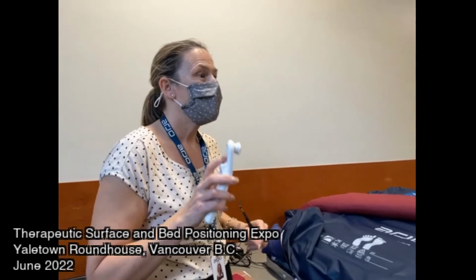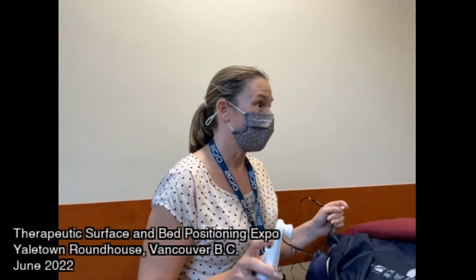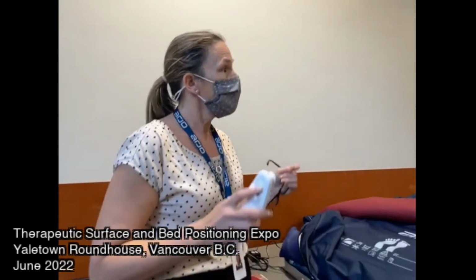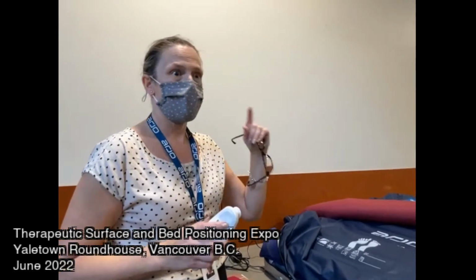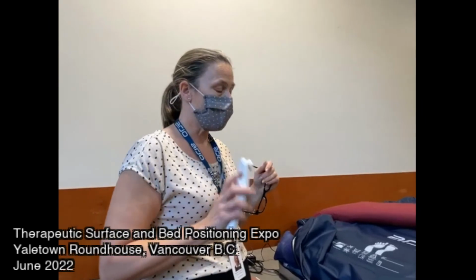Oh, interesting. So you could prevent pressure injuries entirely. And it's also great for monitoring when people come into your facility. Does this person have high subepidermal moisture measurements? It's actually a delta of the different measurements you take.